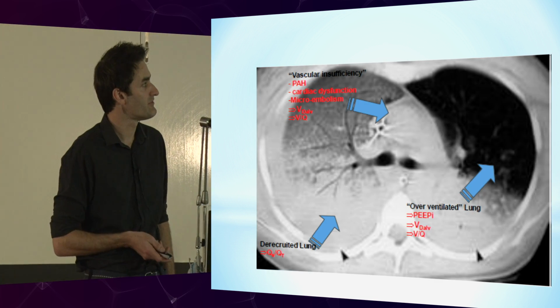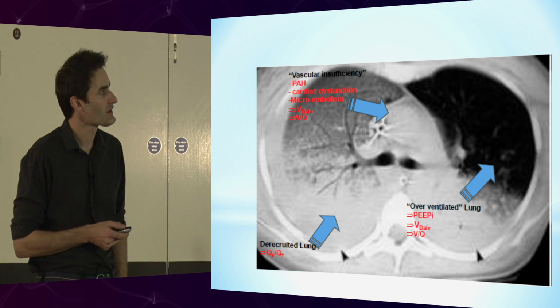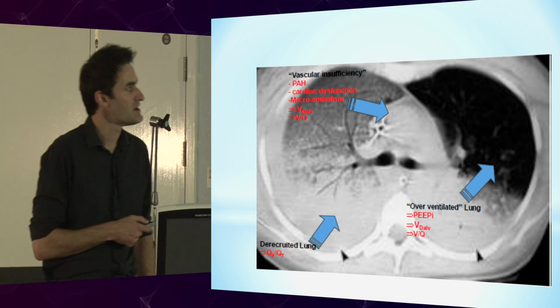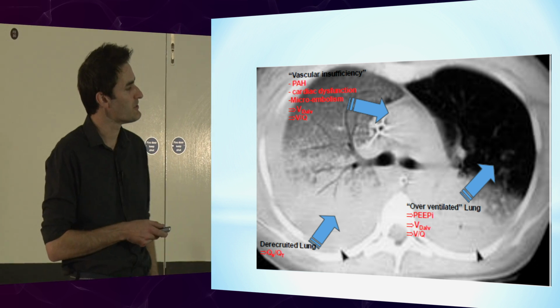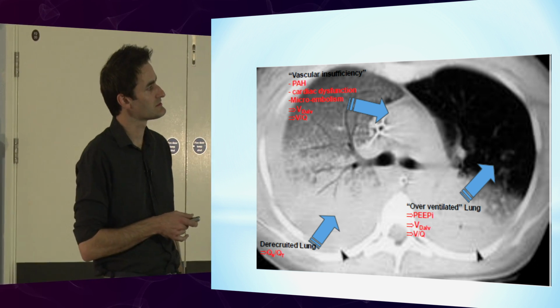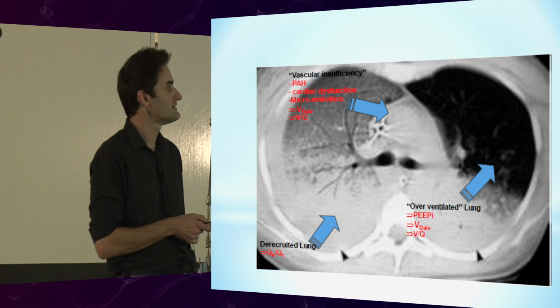Now, a little bit of physiology. I'm sure you've probably all seen this slide. It's a well-used one. ARDS lungs, okay? So for those of you uninitiated in CT scans, which I'm sure is very few of you, but anyway, just the very basics. So bottom of the lungs, top of the lungs, what we've got is lots of consolidated, collapsed lung down at the bottom here, lots of secretions.